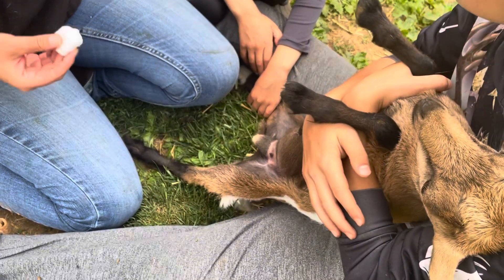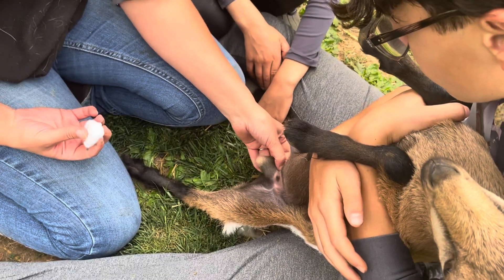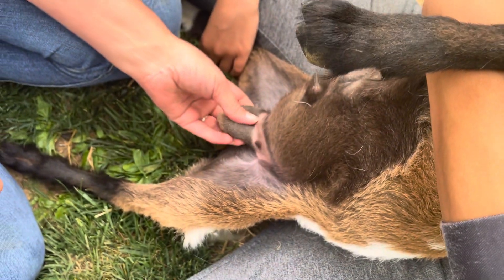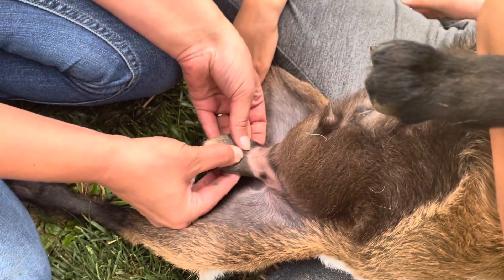I'm going to do a quick educational video on banding — banding Nigerian dwarf goats. They're going to be wethers. So we just want to make sure that the testicles are down before we apply this band.